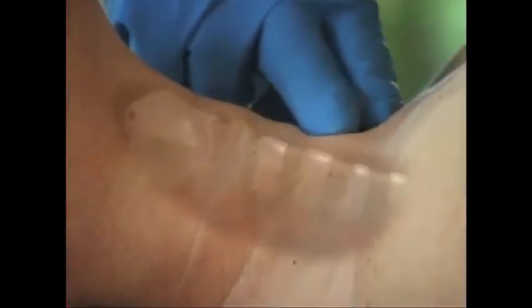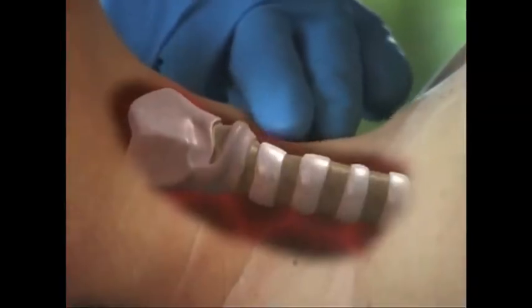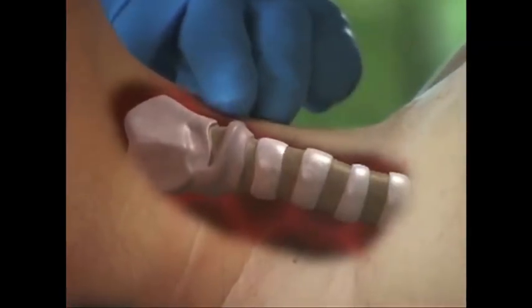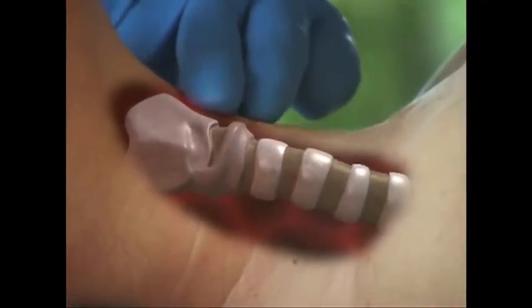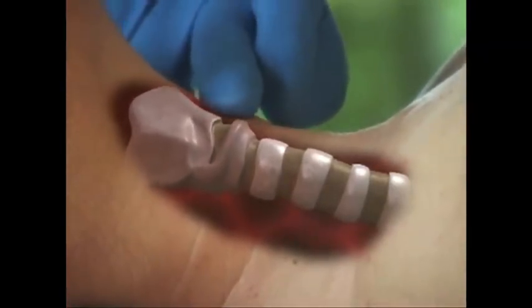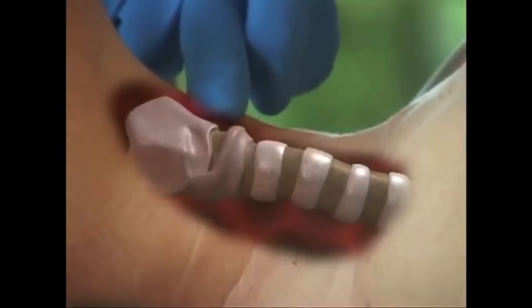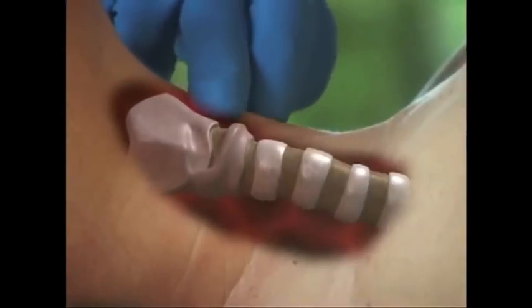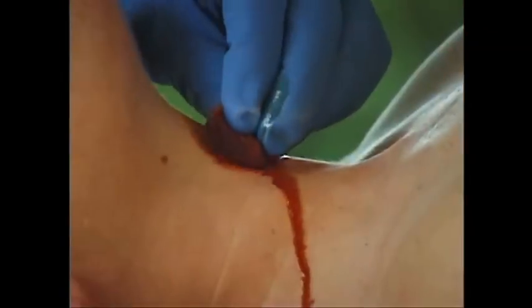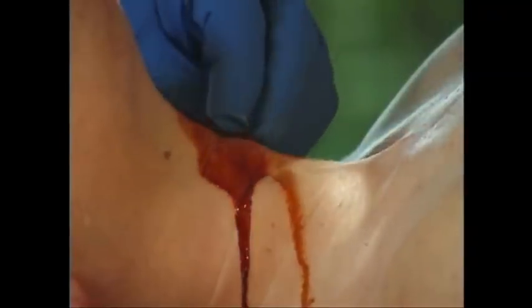Locate the cricothyroid membrane between the cricoid and thyroid cartilages by palpating the depression caudally towards the feet from the midline Adam's apple. Clean the area well with betadine solution.